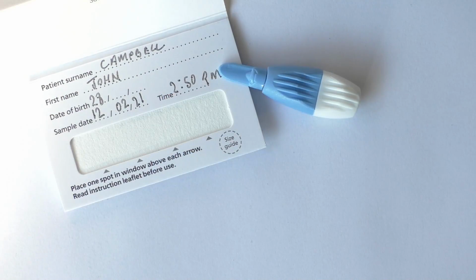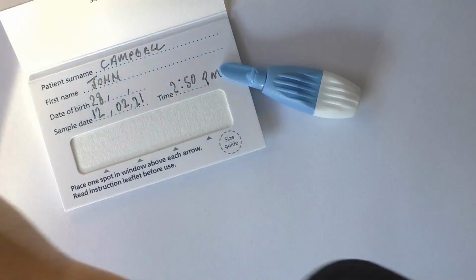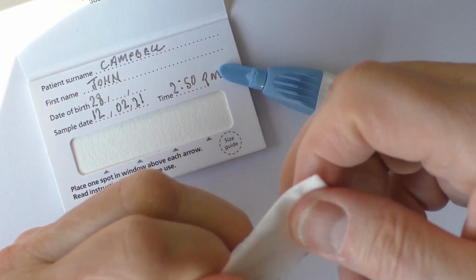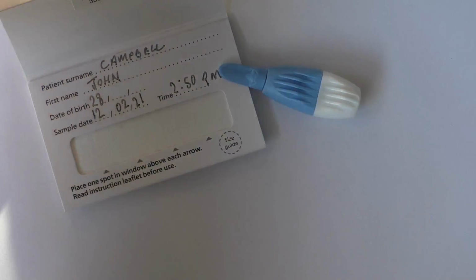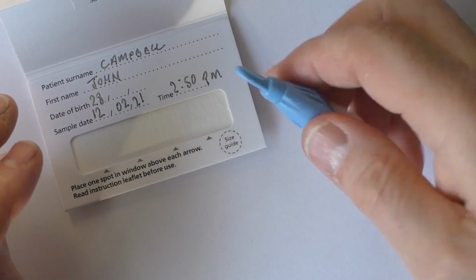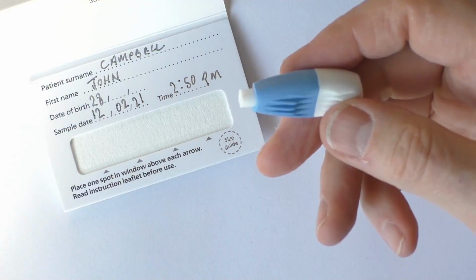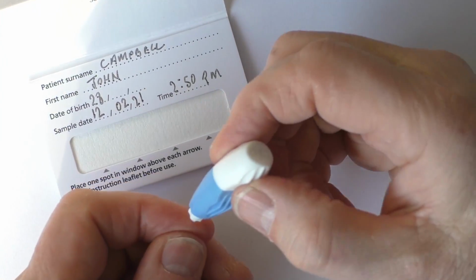So the first thing, let's go on to the overhead. First thing is I need to clean my finger. So they give you an alcohol swab for that. So we'll give that a bit of a clean. There we go. Let that dry. Now they give you these pricker things here. I haven't used this particular type before, so let's hope this works. So we'll give my finger a good old prick.